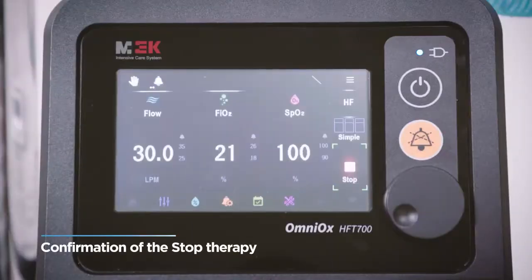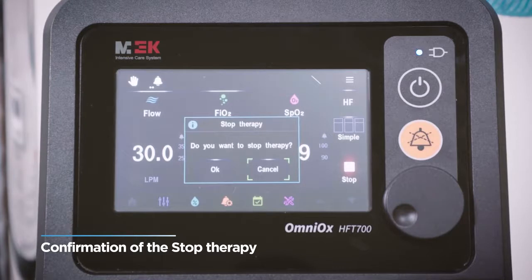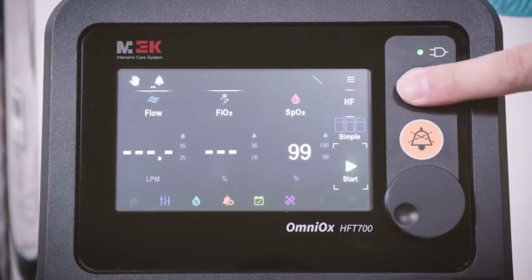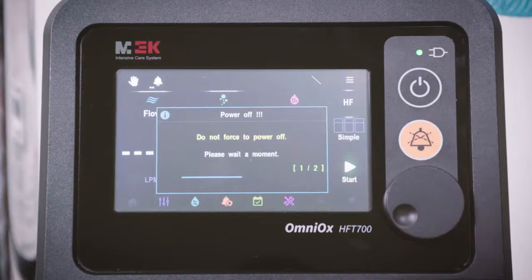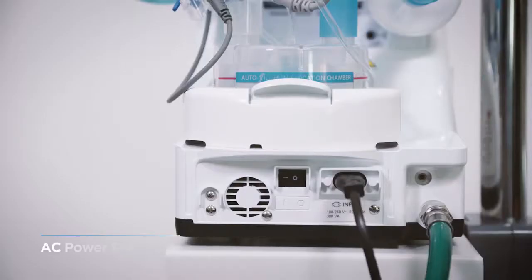To stop treatment, press the stop button on the screen or press the power button briefly, and a pop-up window will appear to confirm the treatment stop. Select OK to stop treatment. After stopping treatment, click the power on/off button for about 2 seconds and a pop-up window will appear to confirm power off. Select Yes to turn off the power. Then turn off the AC power switch on the rear side of the device.